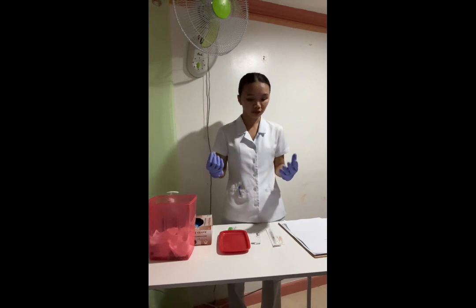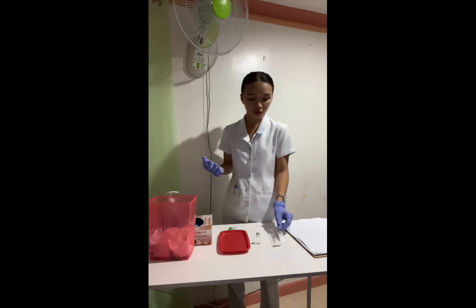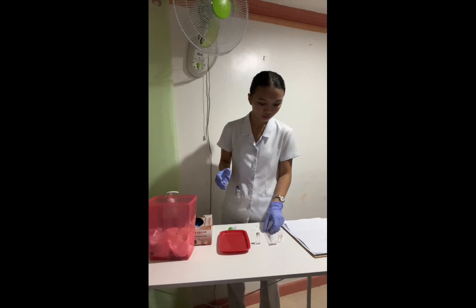And then the next thing we are going to do is we have to withdraw the medication. First is we are going to attach a filter needle as agency practice dictates. So draw up premixed liquid medication from multi-dose vials. By using a vial or filter needle prevents any solid particles from being drawn up through the needle. And also we have to ensure that the needle is firmly attached to the syringe, because any loose attachment of needle will not draw the medication properly. And then after that, we have to remove the cap of the needle.